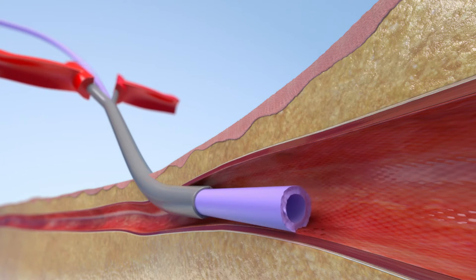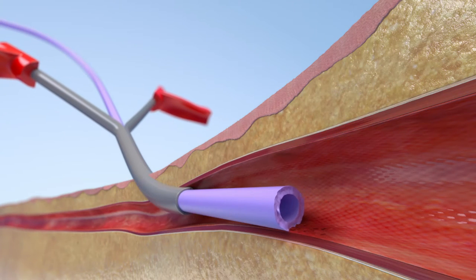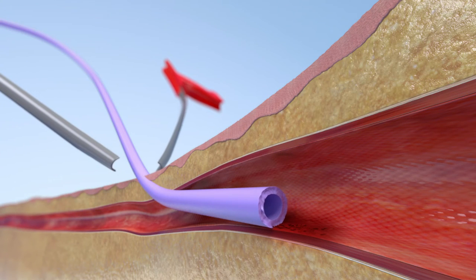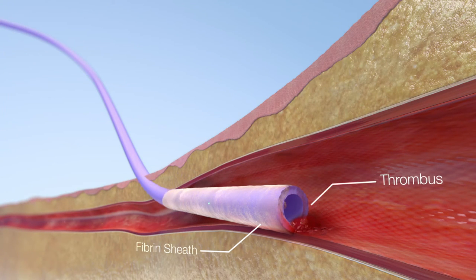As the introducer sheath is peeled away, the catheter is at first slightly retracted and then pushed forward again. This happens repeatedly in the process of cut catheter insertion. In essence, injuring and re-injuring the delicate intima of the vessel, creating the perfect substrate for the development of thrombophlebitis.